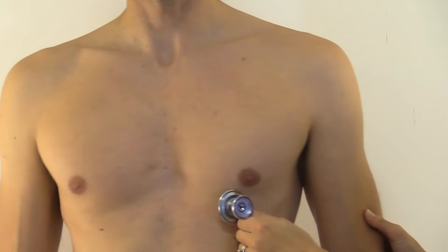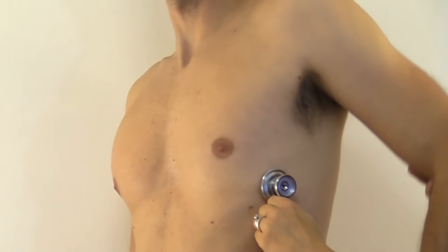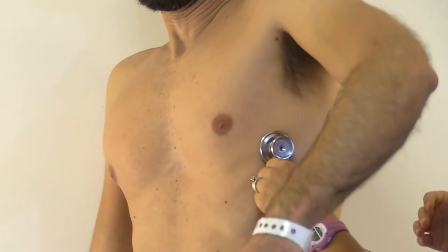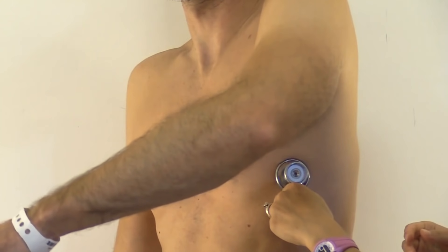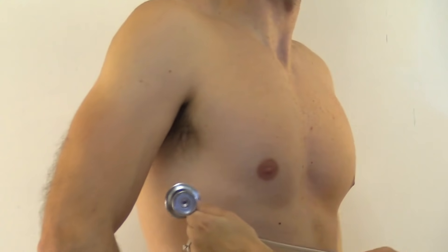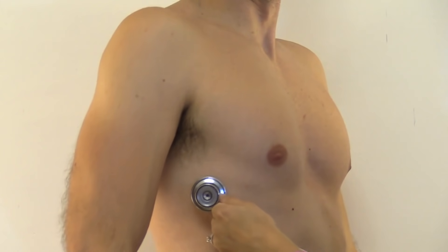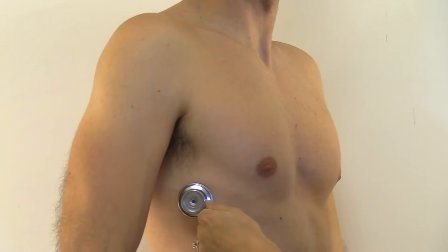Then we're going to go to the mid-axillary line at the sixth intercostal space and listen to the right and left lower lobes. Turn to the side, take a good deep breath in, then do the other side.